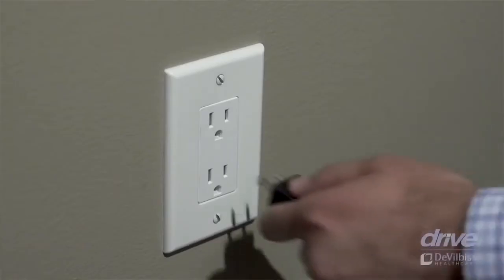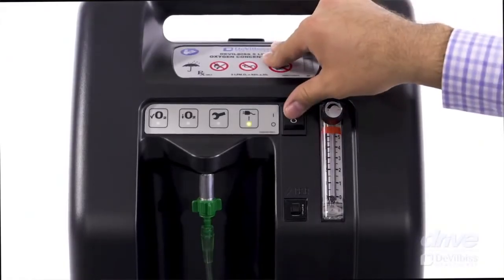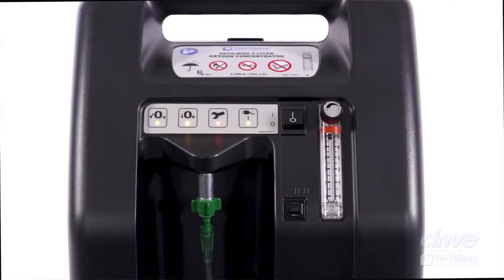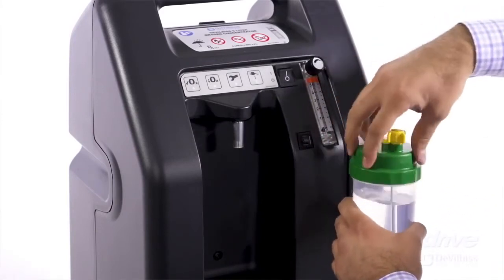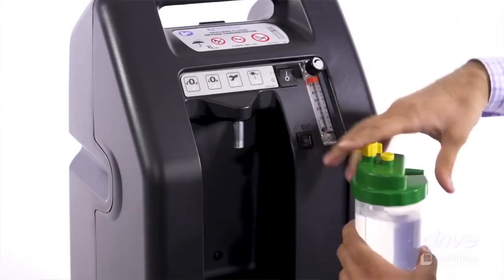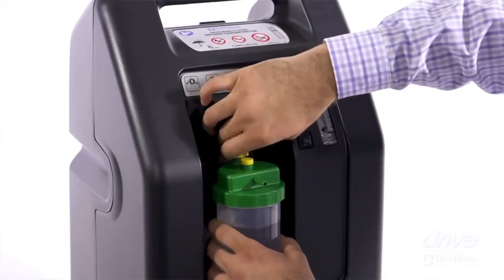The next question is, how do we use an oxygen concentrator? It is a very simple thing to use. It works on electricity, so it has to be connected and pressed on. Humidification, which is a common thing we use, is provided by filling the bottle with distilled water and connecting it. The tube dips into it and we can see the oxygen bubbling when we set the rate at 1, 2, 3 or 4 liters.